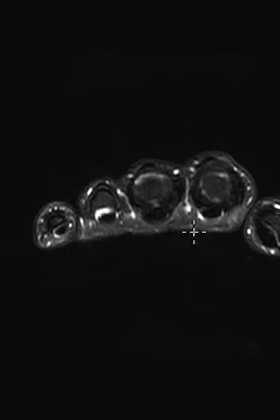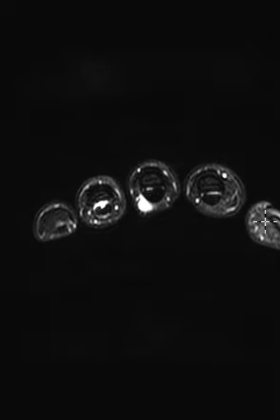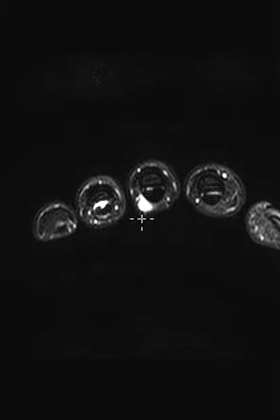It's near the palm, and we can see on this view we're slicing in short axis through the hand, going out into the fingers. You can see the thumb here, this is the pinky finger, and the bump is right here, this little bright spot. That is a little fluid pocket adjacent to the third finger. We can see it's within the subcutaneous soft tissues.